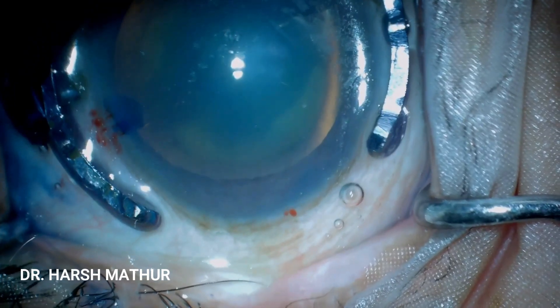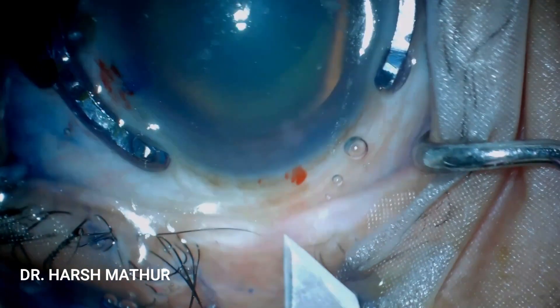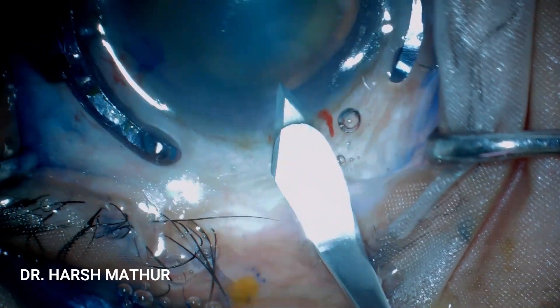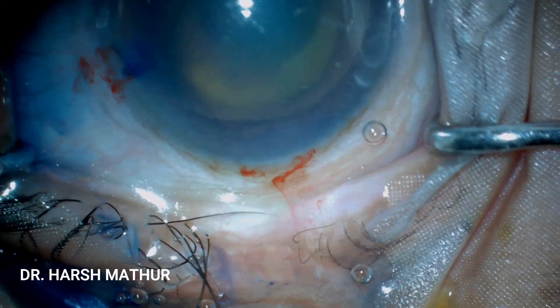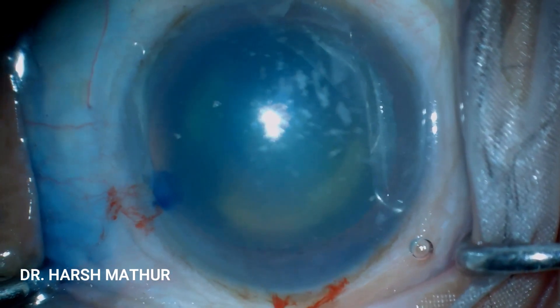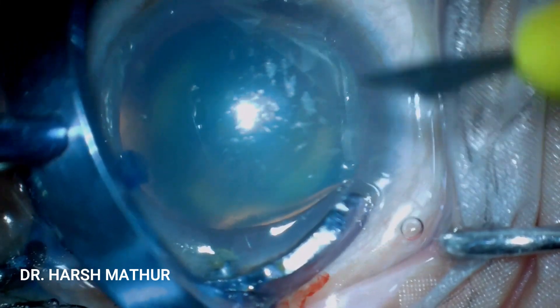Now the main incision is being made. It is a triplanar incision by a 2.8 mm keratome, barely making the limbal vessels. Now a side port is being made approximately 3 o'clock hours away from the main incision.